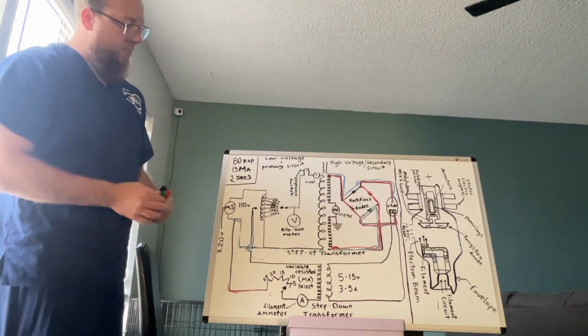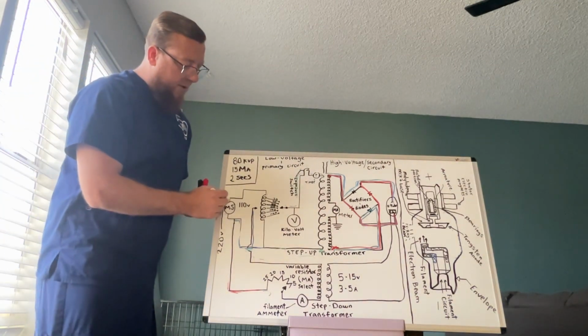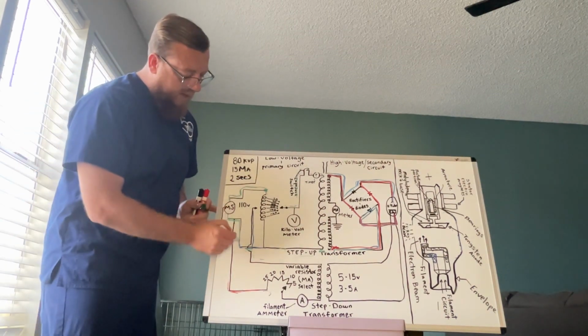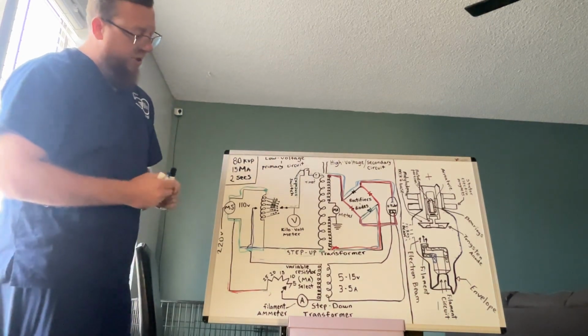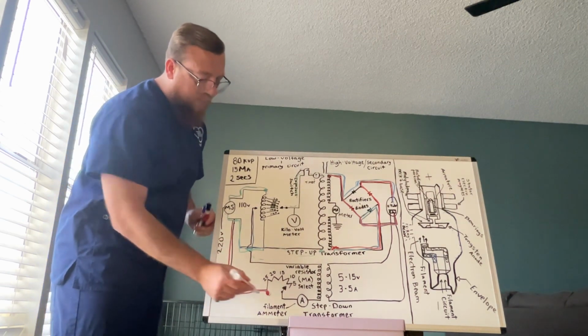And at this time, we're going to have 3 lines of electricity going at the same time. Our first line is going to start here, and it's going to go up to the top of this portion right here. Our second line will meet at the bottom portion here. And our third line of electricity is going to start here, and it's going to go all the way down into our filament circuit and to this point right here.